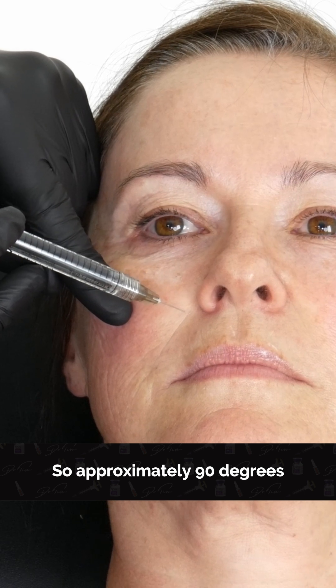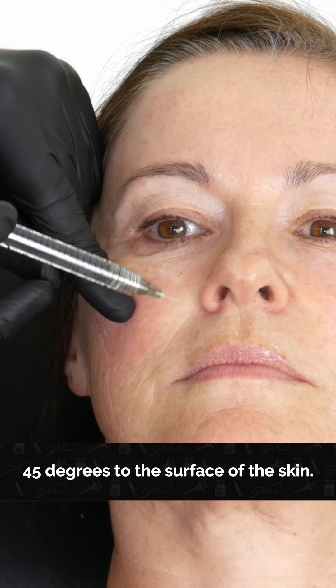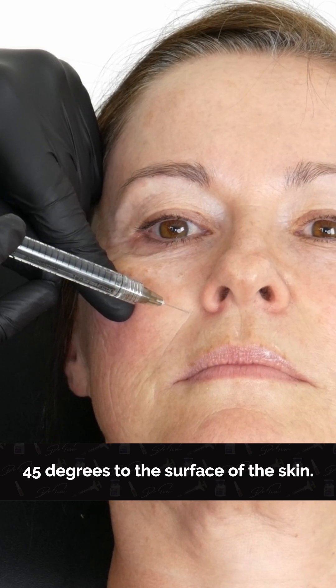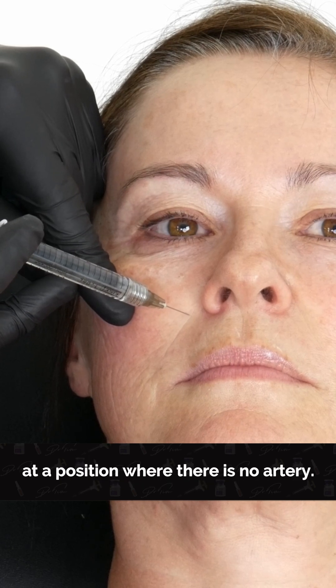Approximately 90 degrees to the nose, 45 degrees to the surface of the skin. That should land me in the pre-zygomatic space at a position where there is no artery.